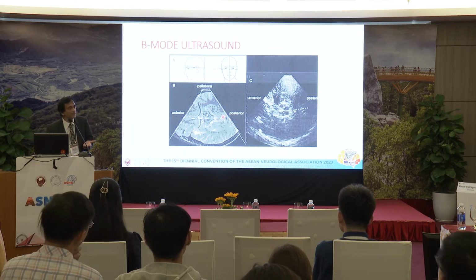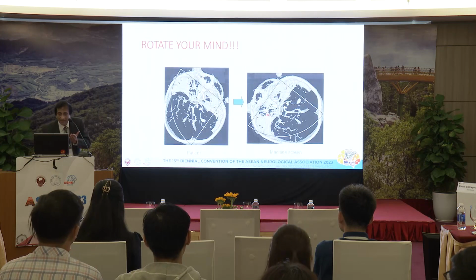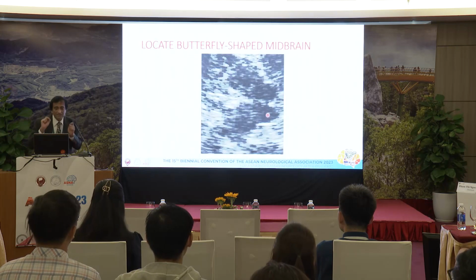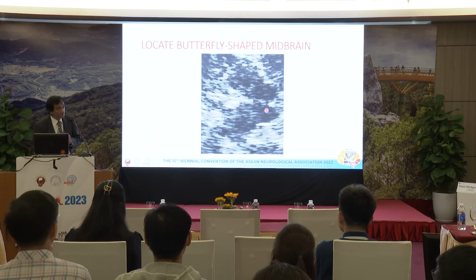And this is the MRI equivalent. What you see here is what you see here. The next thing is to find the midbrain very clearly again. You see beautiful peduncles here and the midbrain here.